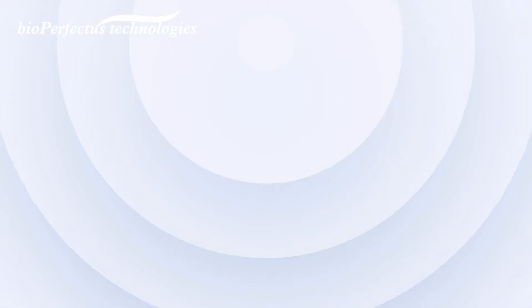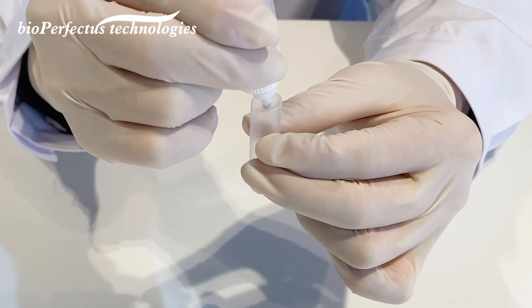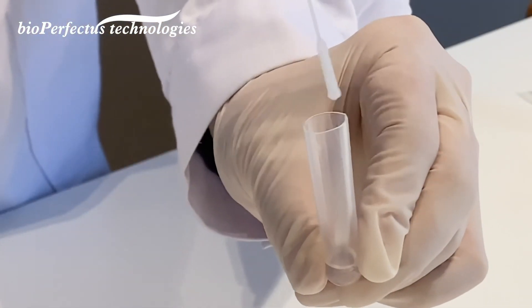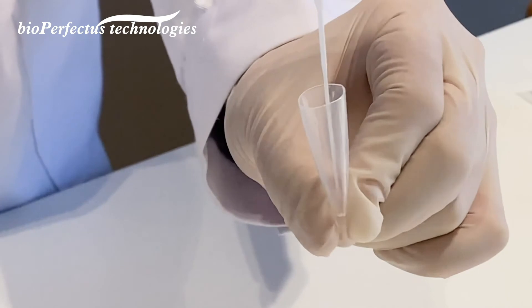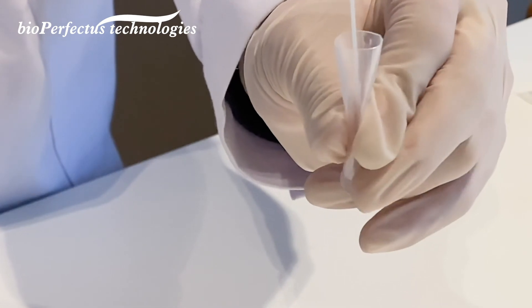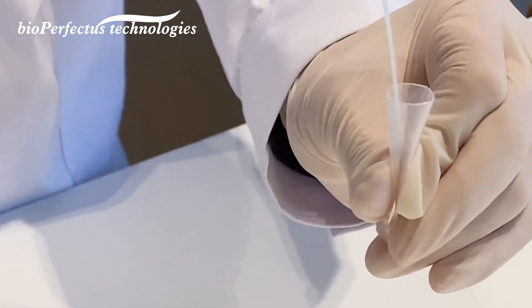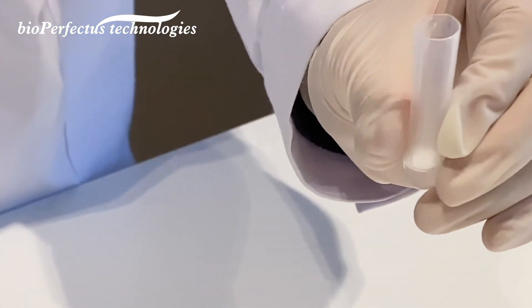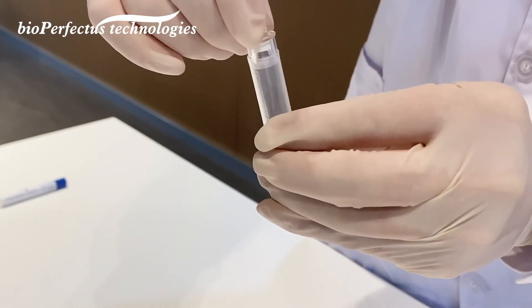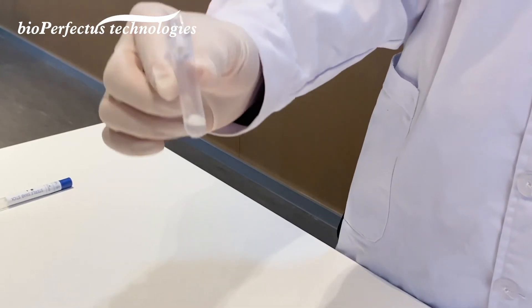Step two: take out the extraction tube and add the extraction buffer to the scale mark. Put the swab into the tube, thoroughly squeeze the tube, and rotate the swab. Then cover the tube with the dropper.